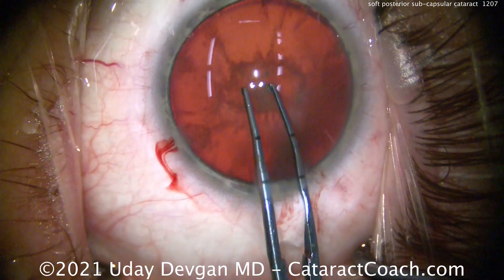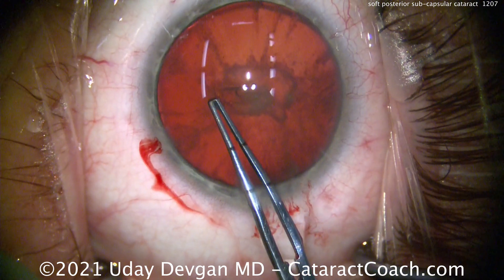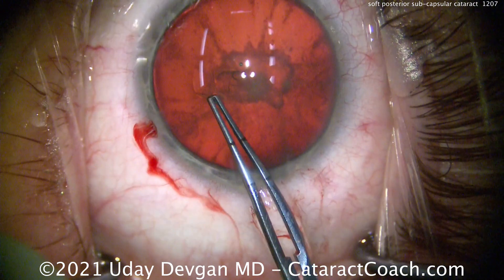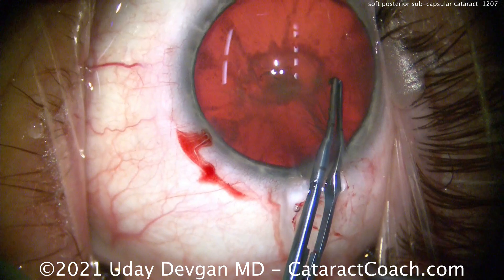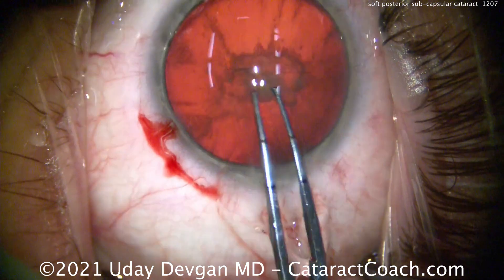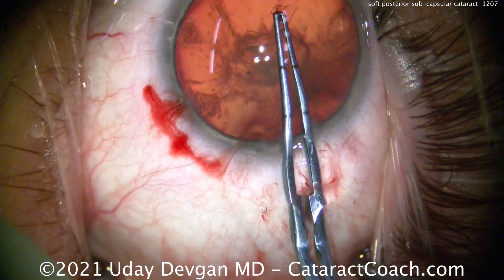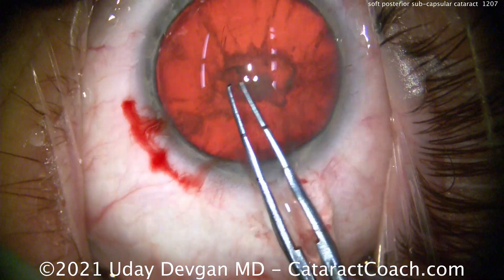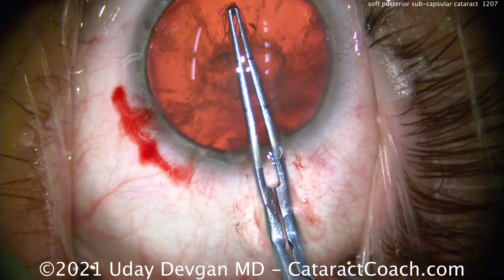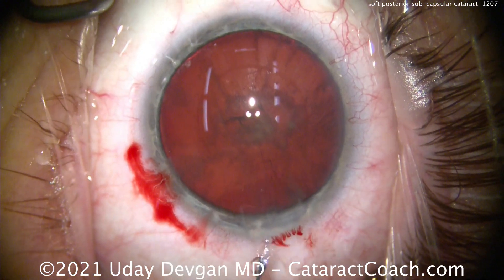Now measuring out the capsulorhexis, centering it on the patient's visual axis using the Purkinje images. Starting the rhexis by poking in with the forceps and beginning the tear. In a young person the capsule is more elastic, so take your time. This patient is myopic with a larger white-to-white — notice the huge dilation. Do not use the iris or pupil size to judge the capsulorhexis; I measure it specifically with the forceps. That comes out to a perfect five-millimeter rhexis.